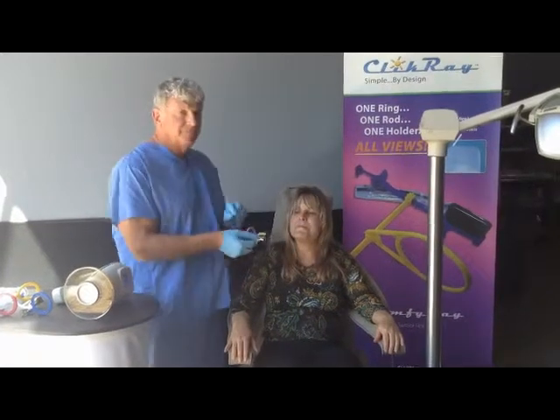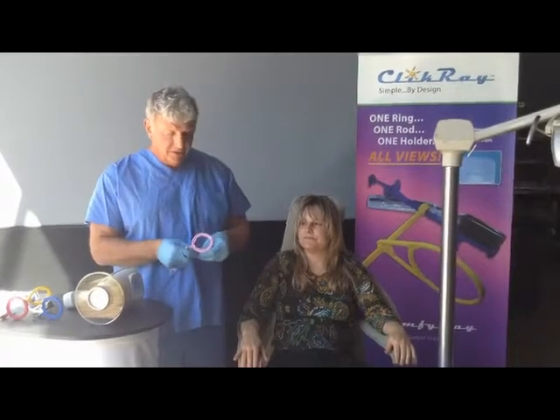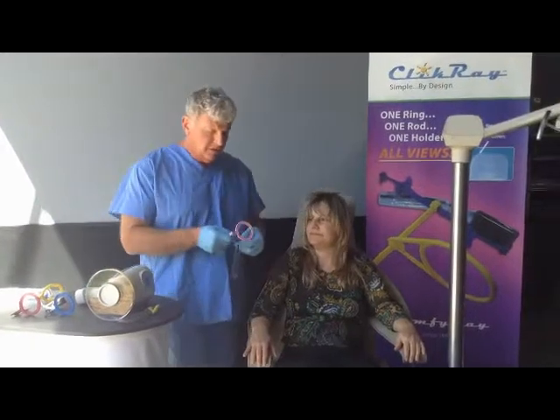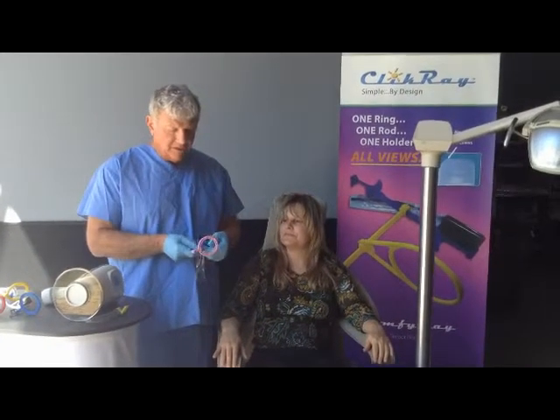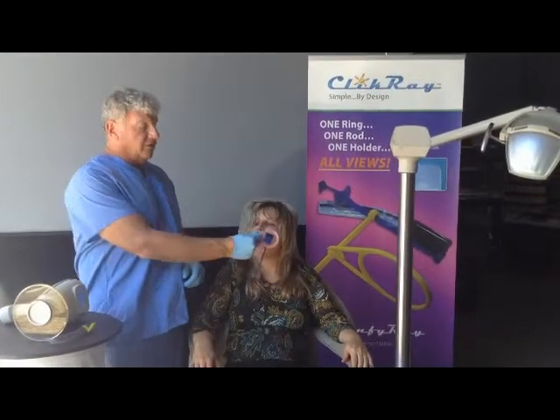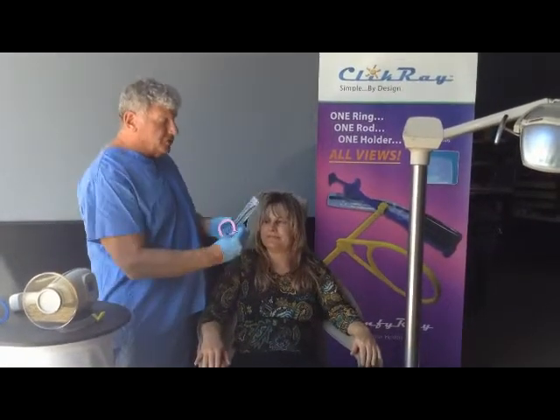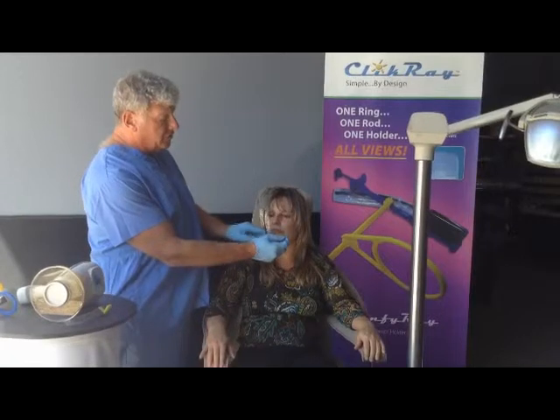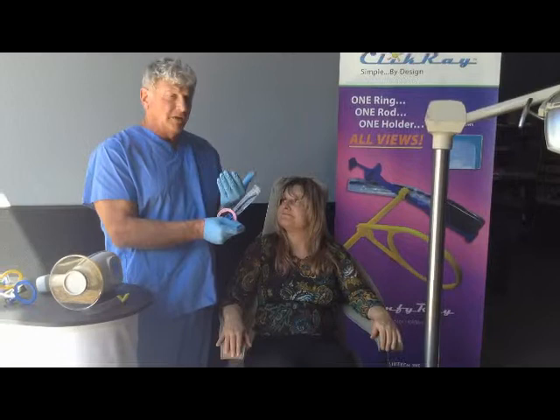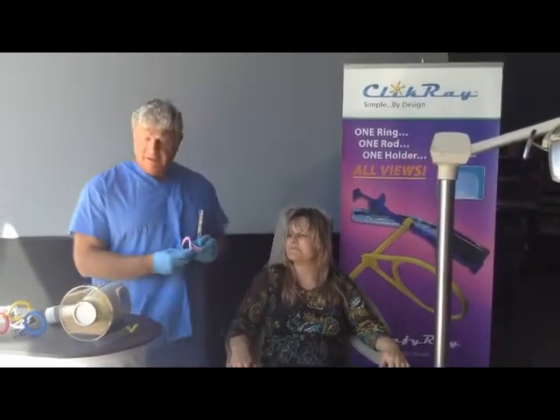Again, we can push this in to get as close as possible without interference from the scatter shield. To take an anterior view, all we have to do is simply take this off and replace the bite block with the anterior. Again, the patient would bite down for the three uppers and the three lowers. If there is any problem getting close or you're concerned, we just turn it around like we showed you on the left and right hand side, so you don't have to worry about getting close to the cheek on that particular side.